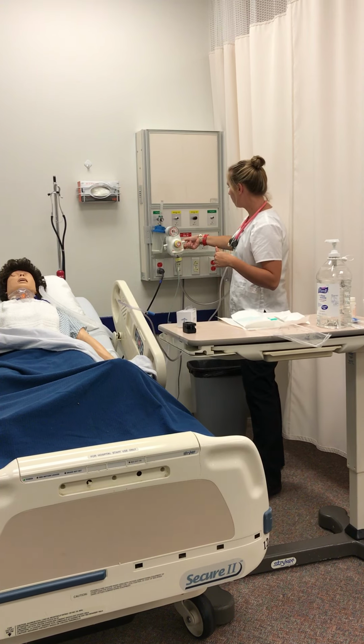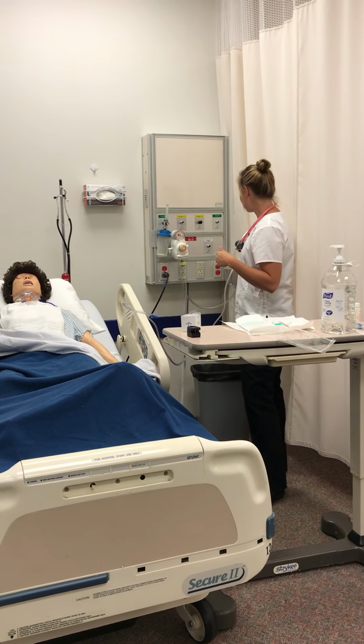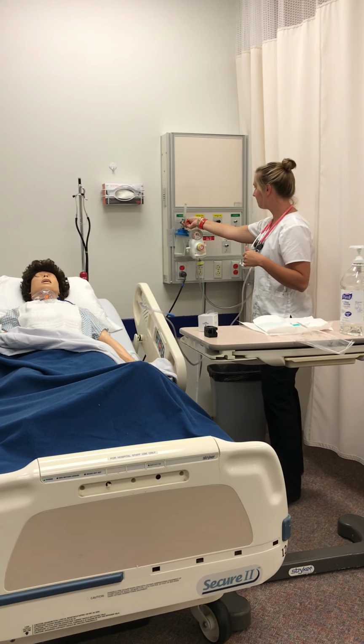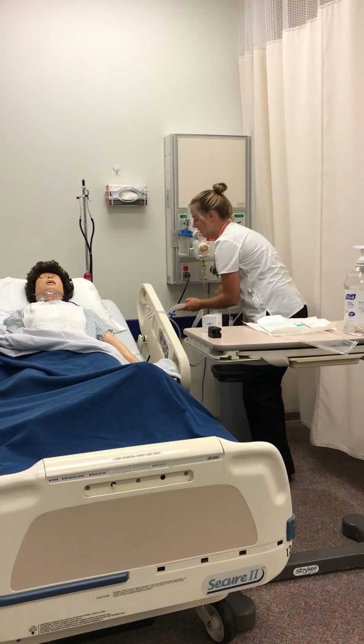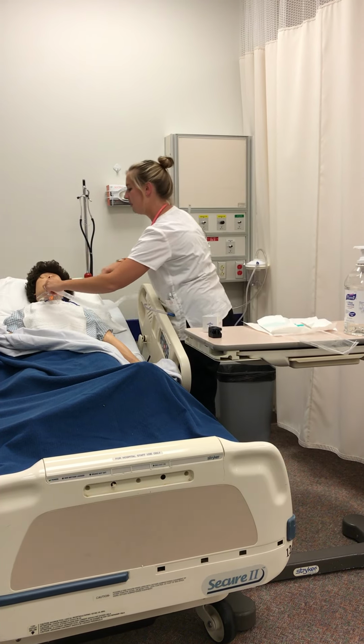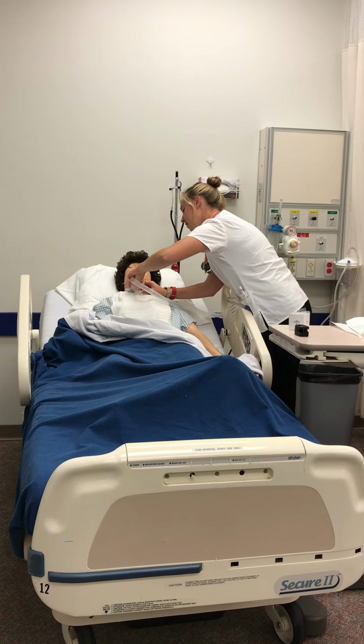I'm going to turn off that and lower oxygen. This seems to have fallen. There you go, Gretchen.